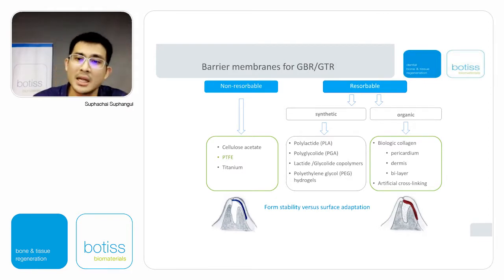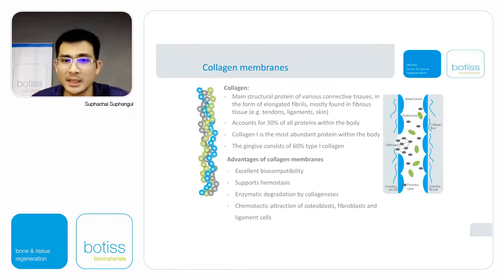However, the cross-link process uses chemicals that can induce inflammation in the healing area. The collagen has very excellent biocompatibility and can resolve by itself. It depends on the structure of the collagen membrane.